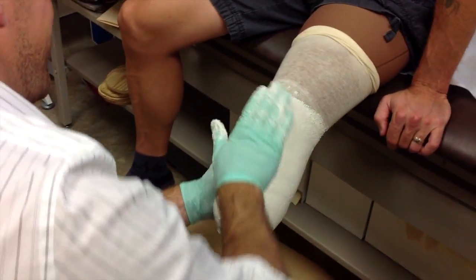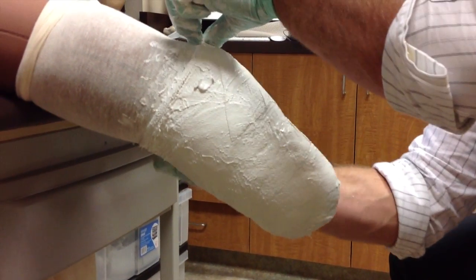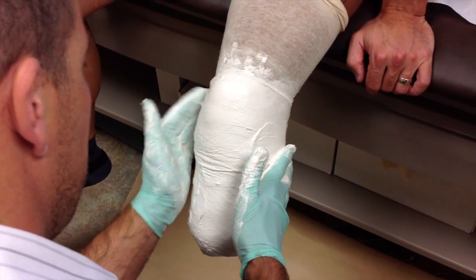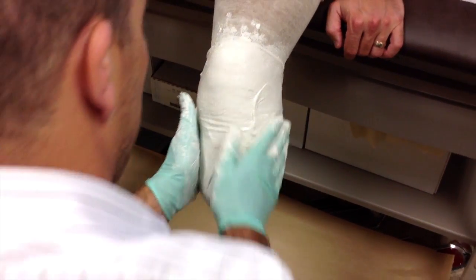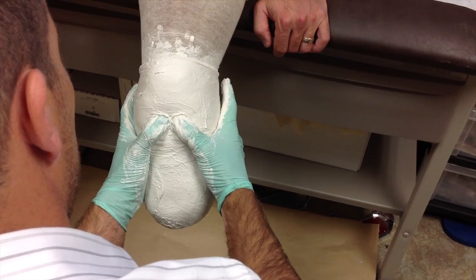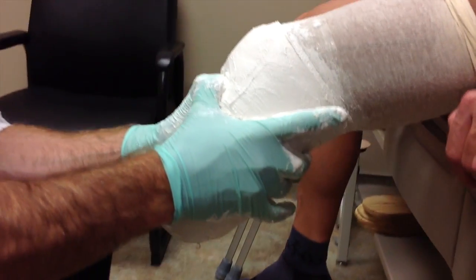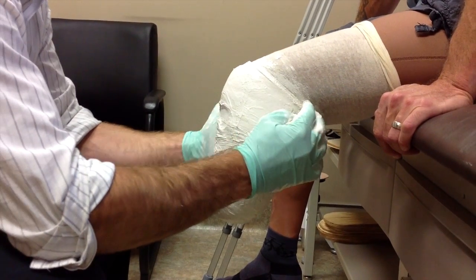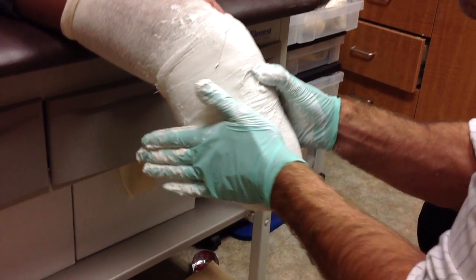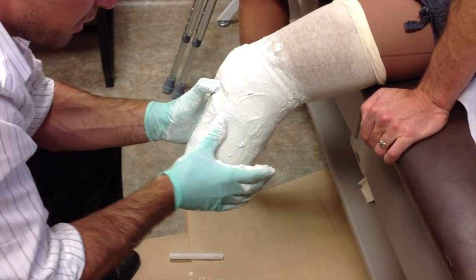The practitioner will then use their hand skills to mimic what would be happening in the socket with your limb. They'll apply pressure to pressure-tolerant areas and make sure to well-define pressure-sensitive areas so that they can relieve or capture them in the impression. As the plaster hardens, the practitioner continues to work the plaster into the limb in specific ways and continues to define certain bony landmarks.